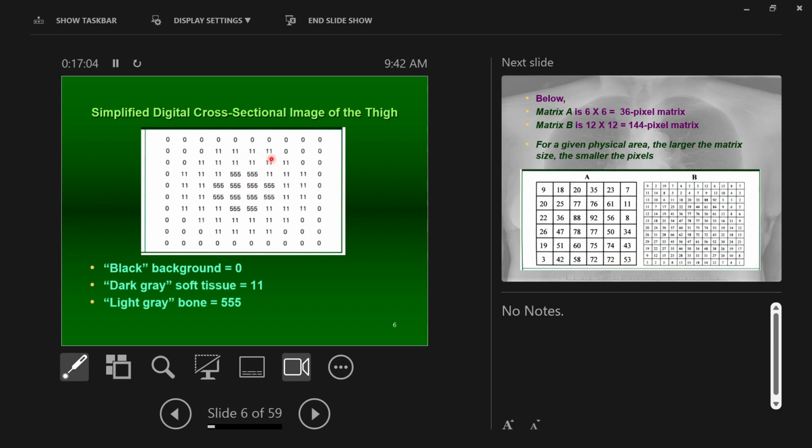It's a little blocky, right? Because these pixels are sort of large, right? But once the matrix gets big and the pixels get small, that blockiness goes away and we see, more or less, a continuous image. But it's always divided up into pixels. Each pixel gets a value.